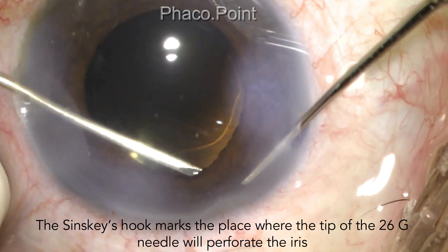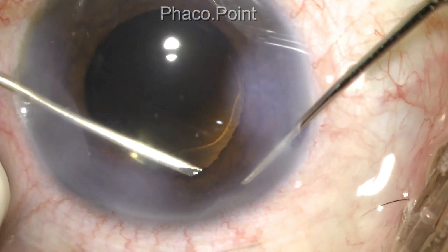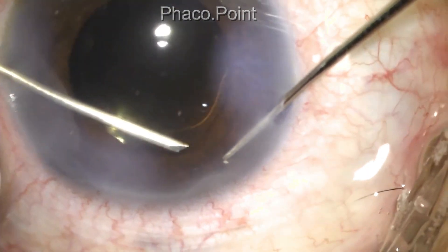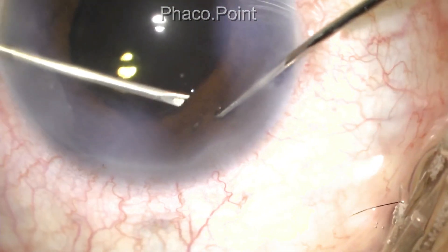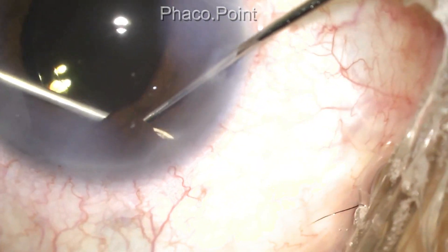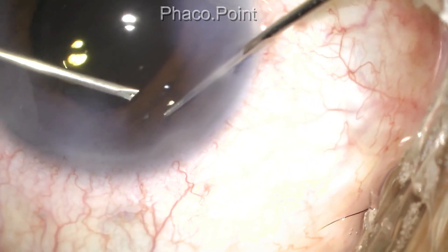Whilst holding it steady, it's tipped gently upwards, whilst at the same time the Szynski hook rubs on the tip of the needle. This results in the surgical iridectomy. The opening created is now suitably enlarged by moving the instruments slightly apart.